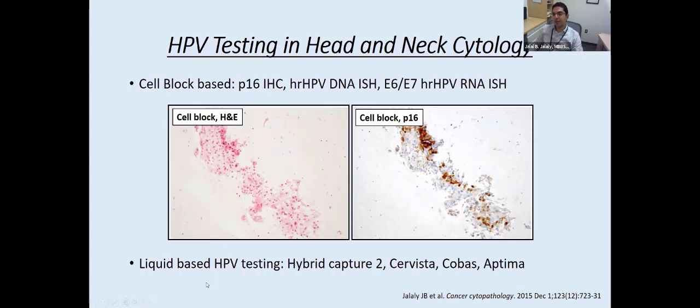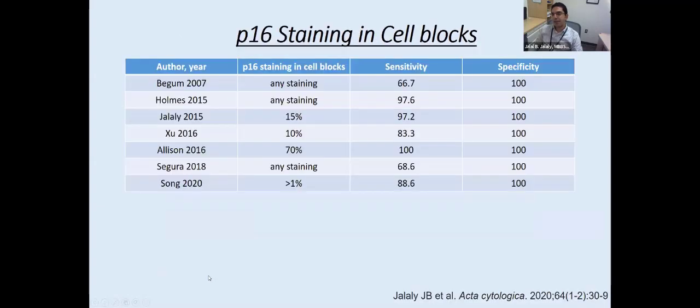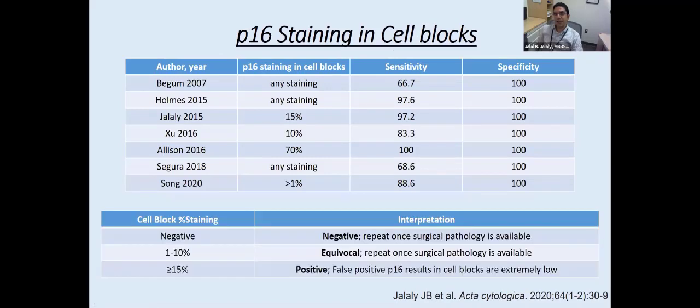Now, the liquid-based HPV testing was mainly validated and is used more frequently in GYN specimens and pap smears, and the different platforms are widely available in cytology lab. And a lot of studies recently have shown that liquid-based HPV testing can be reliably used also in head and neck cytology specimens.